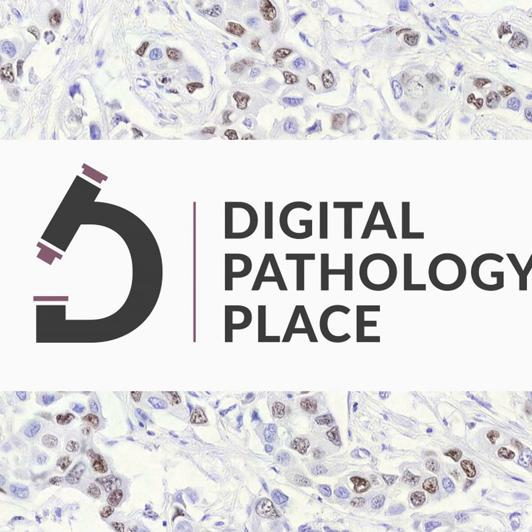So this panel, the choice of your markers, is defined by the scientific question or the diagnostic question that you are trying to answer. Exactly. So if you want to find immune cells, you're probably going to be adding some CD markers. If you're looking for tumor cells, you're going to be adding tumor-specific markers. If you're going to be looking for different expression of activation markers or signal transduction markers, you'd want to combine those all into the panel.